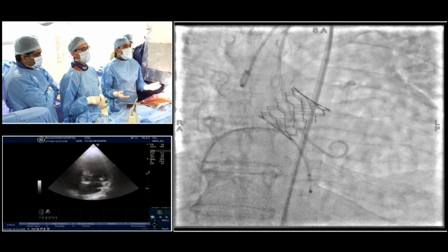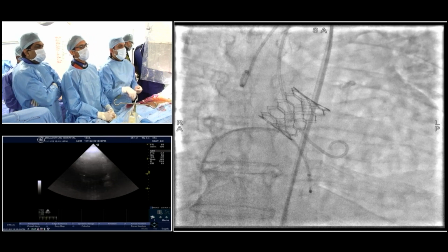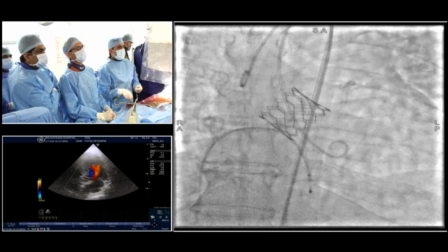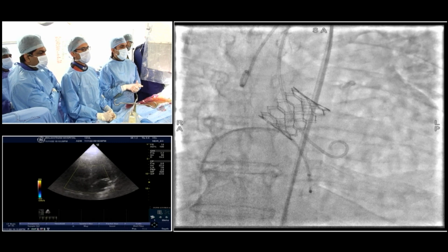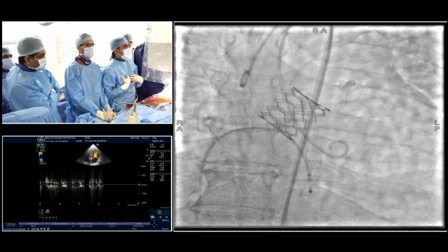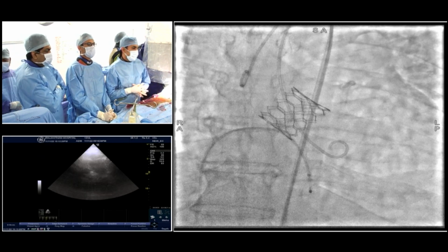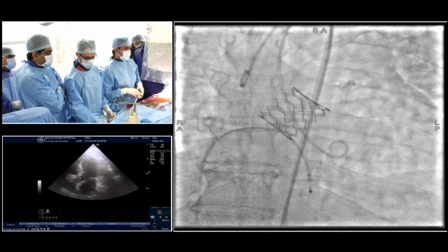With the balloon expandable, this is a combination of pre and post dilatation together. A pre-dilatation can only help a balloon expandable valve to cross the annulus, nothing more than that. But if you think you'll be able to cross the annulus without an issue, the pre-dilatation is not required. That's what I think. And for self-expandable, for sure pre-dilatation in almost all the cases.